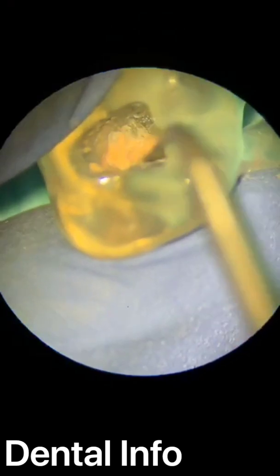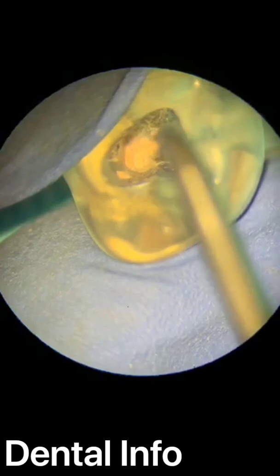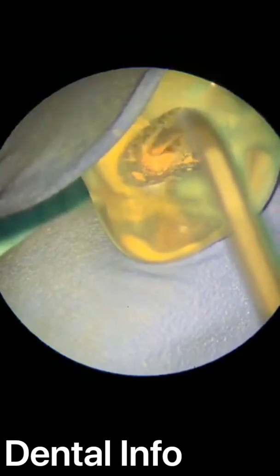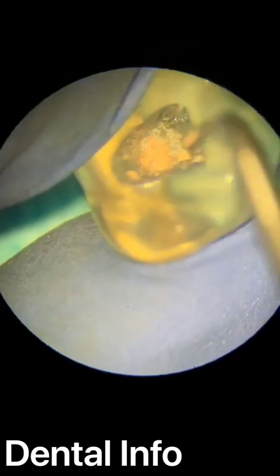See? If you want to remove gutta percha from here, if it's attached and it's a large quantity, you can remove it with the fast pack. But in my case here, I don't want to remove anything. For me, it's fair enough.